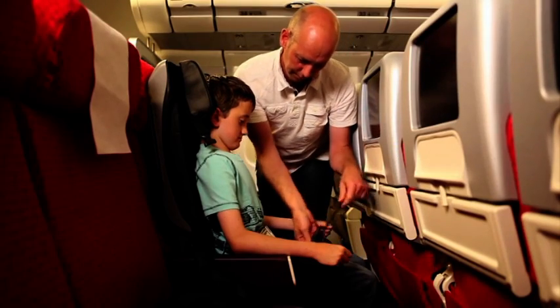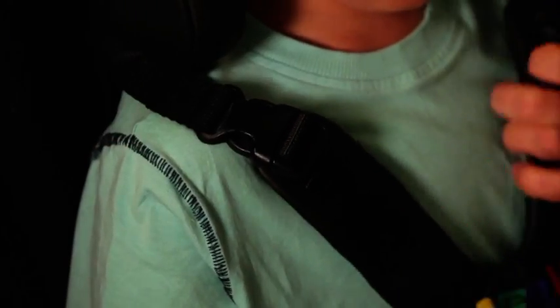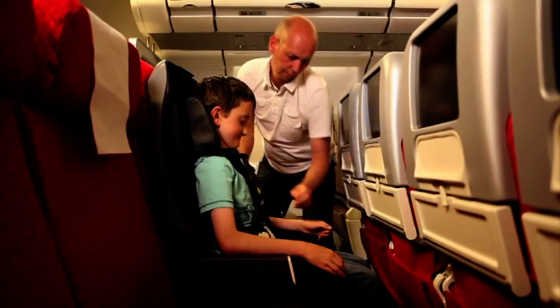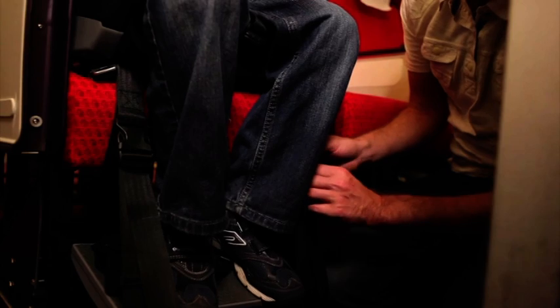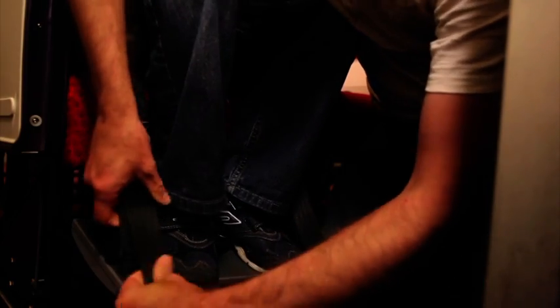If it is to be used, bring the crotch strap up and over the aircraft seat belt and close using the Velcro. Next, bring the headrest down to shoulder level and clip the shoulder buckles, adjusting if necessary. Clip the side buckle and adjust accordingly. The drop of the non-slip footplate can be altered by loosening or tightening the straps as shown, to ensure the correct height and angle for providing adequate support for the child's legs and feet.